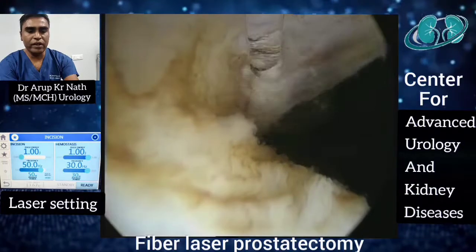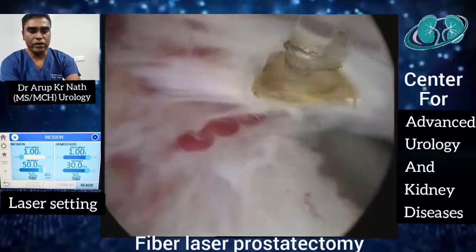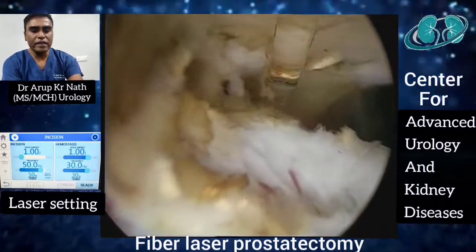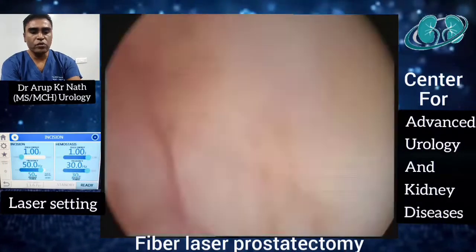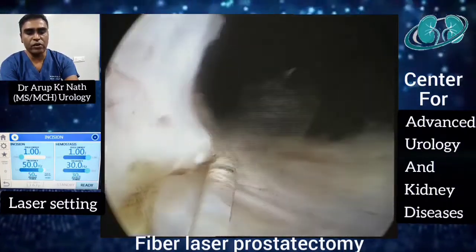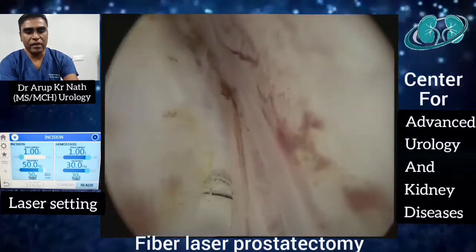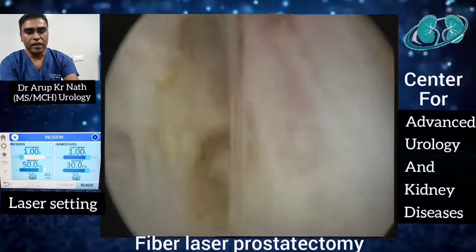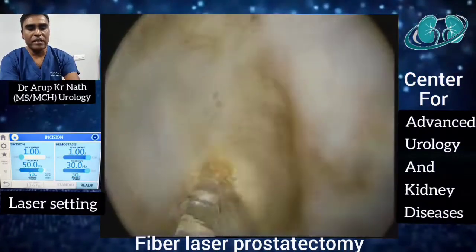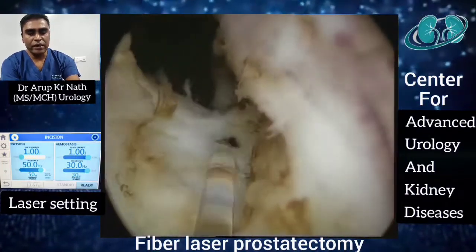That's why at the level of the bladder neck where the fibers are visible, we should activate the laser rather than doing mechanical enucleation. You can see the enucleation process moving towards the midline, and while enucleating at the roof at the 12 o'clock position, we should go a little more from the midline towards the other side. Since we started from the left side, we go a little more to the right. At the floor level, enucleation is complete and the adenomatous tissue has been lifted up. Now we complete the midline incision at 6 o'clock, detaching it from the rest of the adenoma at the floor.